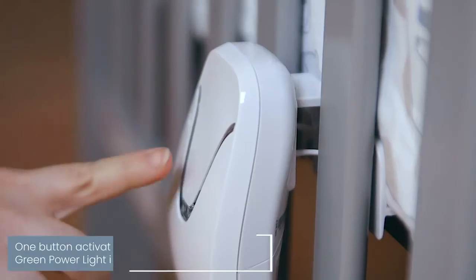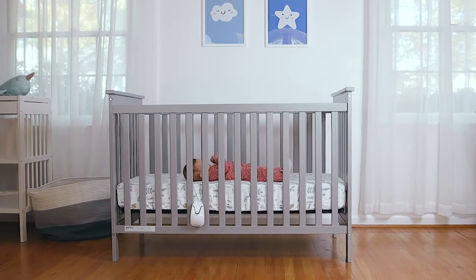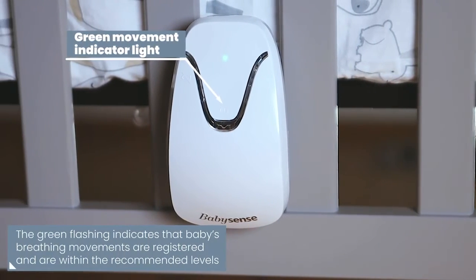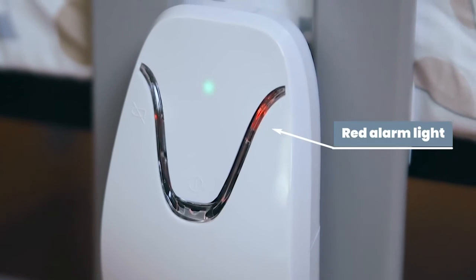Easily activate the monitor by pressing the power button. The green power light indicates that the monitor is turned on. The green flashing light indicates that your baby's breathing movements are registered and are within the recommended levels. If movements stop or drop below the recommended level, an audible and visual alarm will be activated so you can attend to your baby in time.